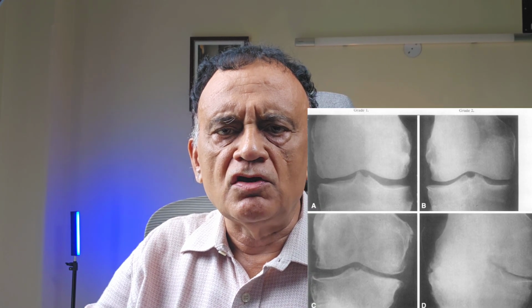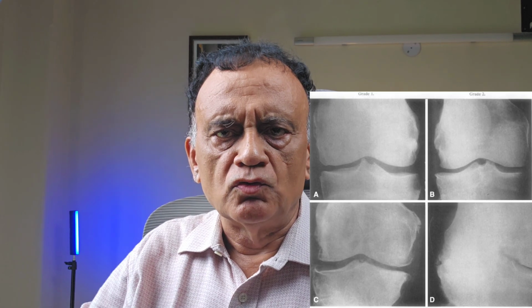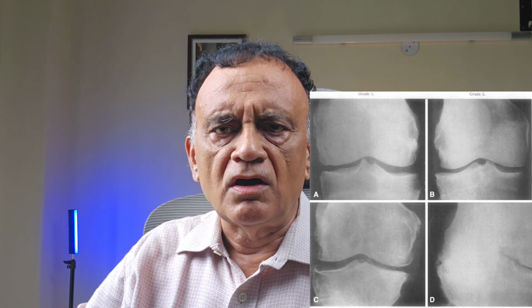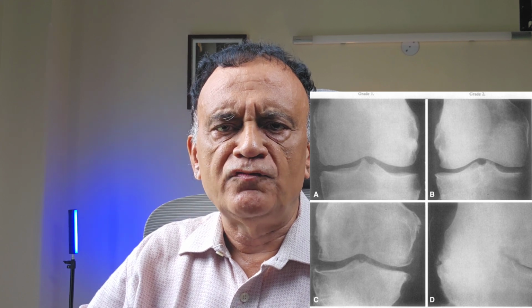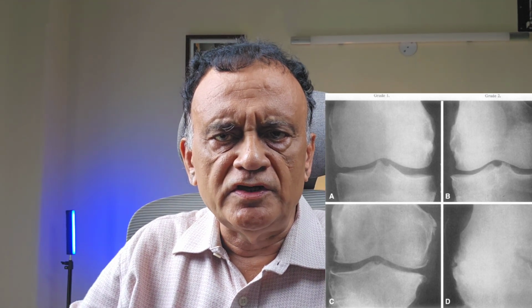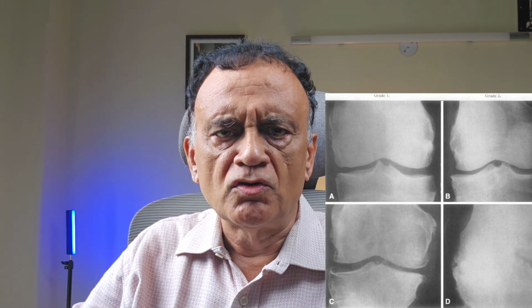Kellgren-Lawrence grading of knee osteoarthritis. Grade 1, doubtful osteoarthritis, just tiny osteophytes or bone spurs, and the joint space, the space between the 2 bones, is normal. Grade 2, mild osteoarthritis, definite osteophytes, minimal joint space narrowing. Grade 3, moderate osteoarthritis, multiple osteophytes, moderate narrowing, early bone deformity. That is, there is more advanced joint space narrowing. Grade 4, severe osteoarthritis, large osteophytes, marked joint space loss, bone-on-bone contact.